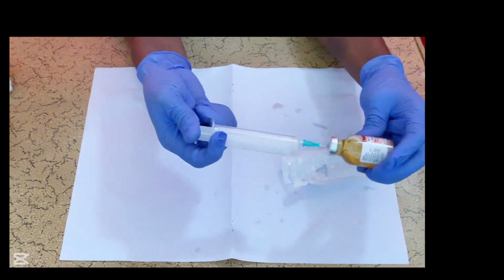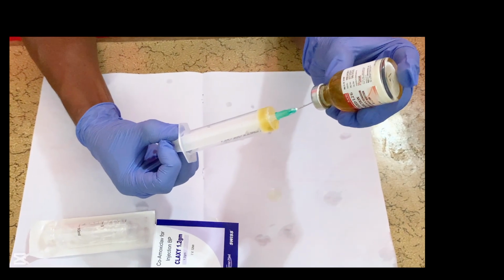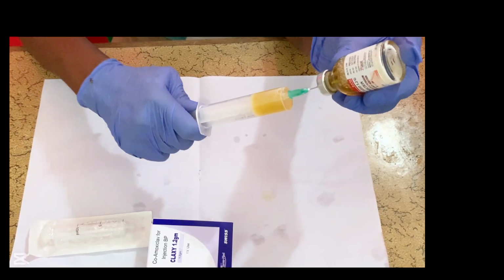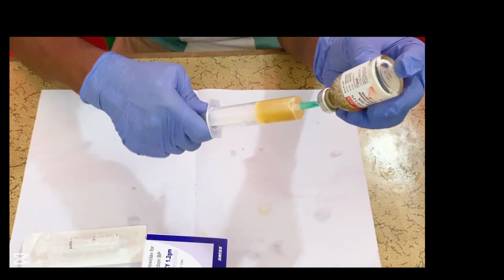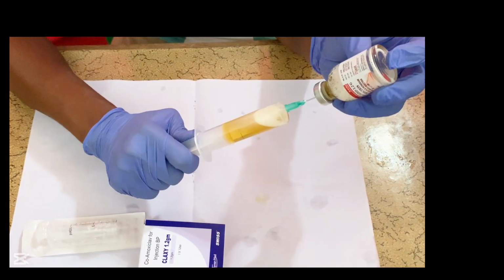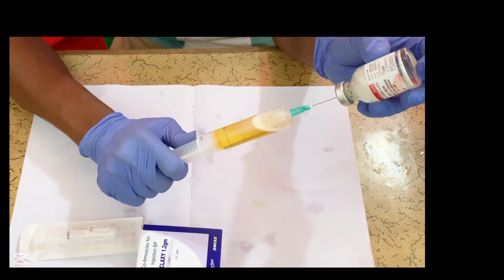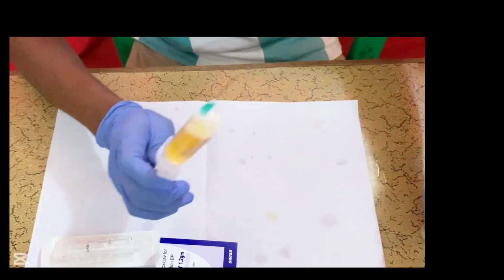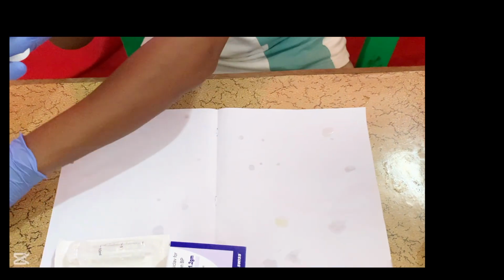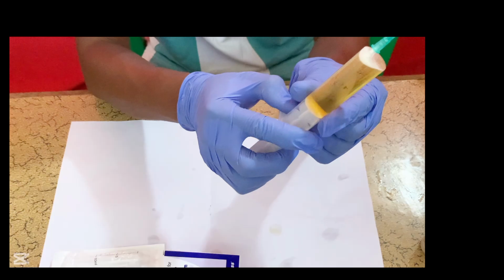Then you hold the vial horizontally. Then make sure you withdraw all the drug from the vial. So it's very simple. This is how you are going to withdraw. Make sure you keep the needle in line with the drug to avoid air bubbles rushing into the syringe. So this is how you are going to withdraw the drug from the vial. When you finish, make sure you remove the needle from the vial. Then you remove any air bubble. Make sure that you remove any air bubble from the syringe.